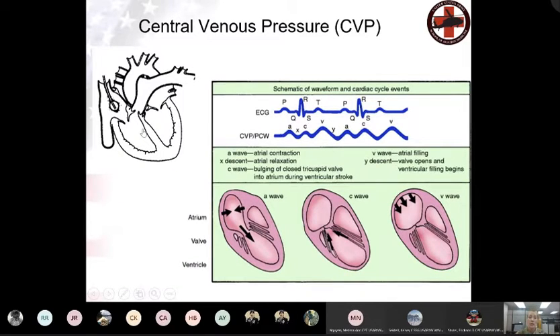Now, here's the deal with that. Your cardiac tissue doesn't like to be poked. It's kind of like me in the morning, I don't like to be poked either. So if we start to see a difference in the waveform than what we see here on our screen, we need to start looking to see if potentially that line has been advanced. If the cardiac tissue is being poked, we have a greater risk of having ectopy, and with that ectopy, we can have some lethal arrhythmias. So having an understanding of what that baseline waveform looks like, so that we can assess for any changes, is critical.